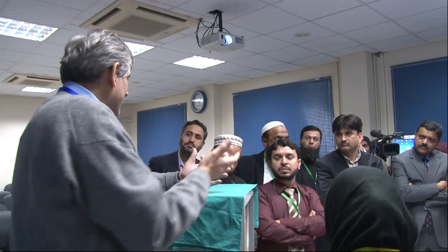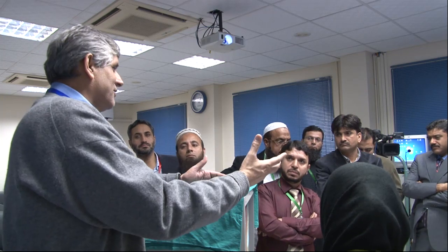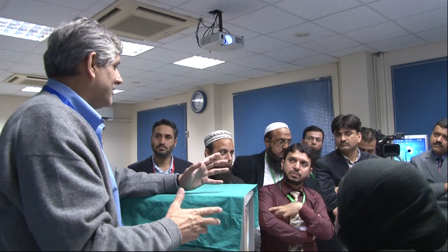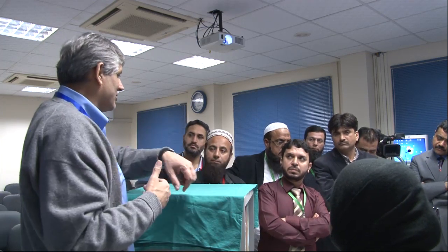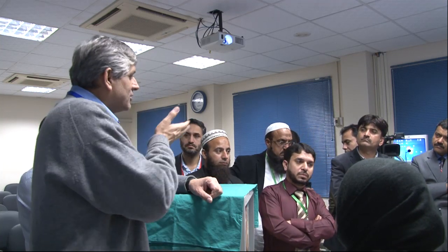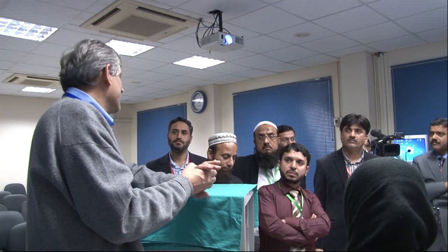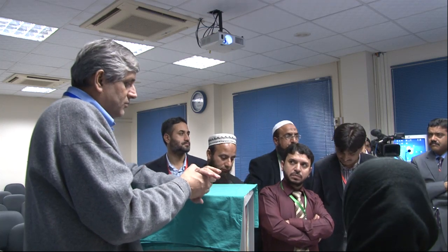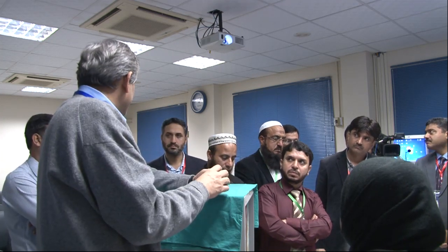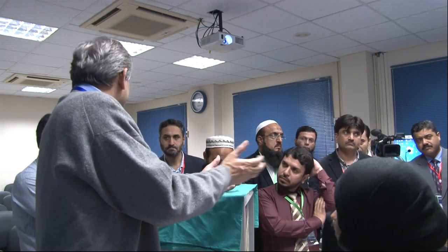You pass it through the pylorus, great. Reduction of the scope, great. Positioning of the ampulla, the ultimate thing. But these are all part of it. You put in too much air, you make life difficult for yourself. You've already got a wrong start for the patient. He's jumping up and down. The simple procedure has now become difficult. You failed not because the patient was difficult. You failed because you actually made him or her so uncomfortable that they were jumping, unless you're doing it under propofol. So all these steps that Waqar and we are going to take you through may be repetitive, but that's all we do. There's nothing special other than what we have just discussed.